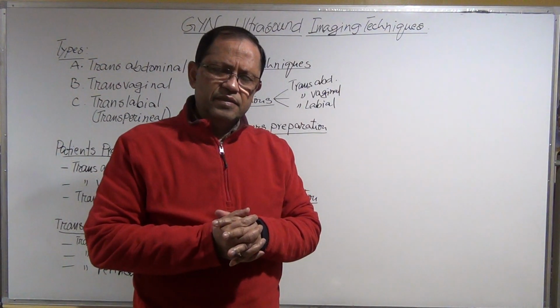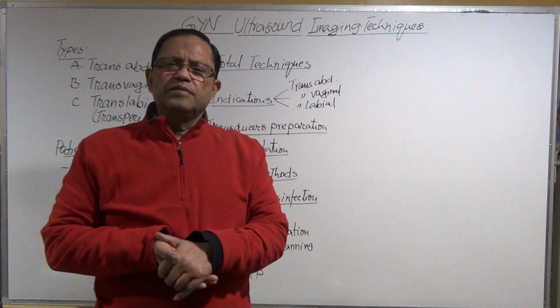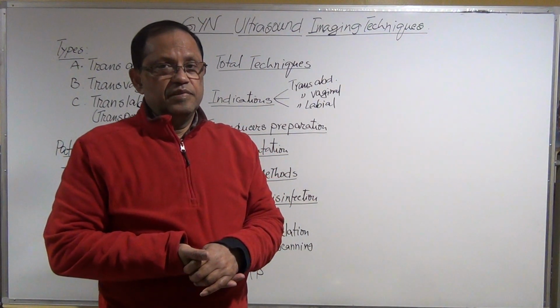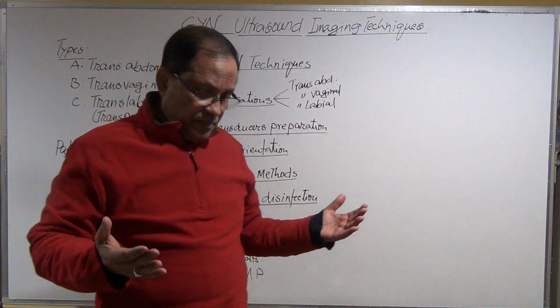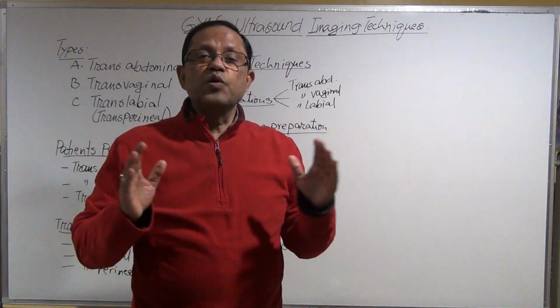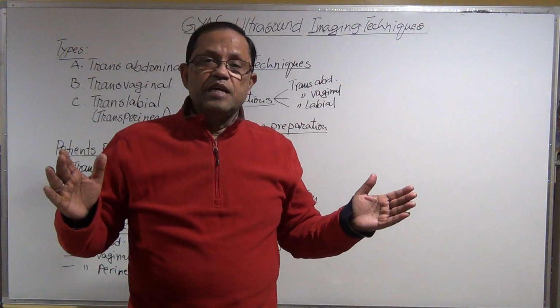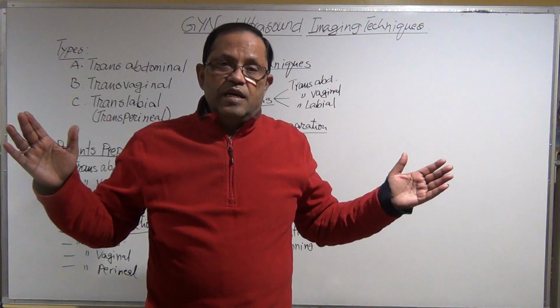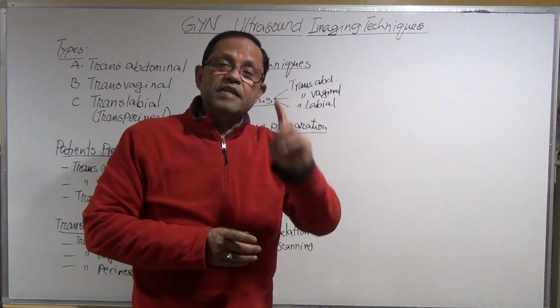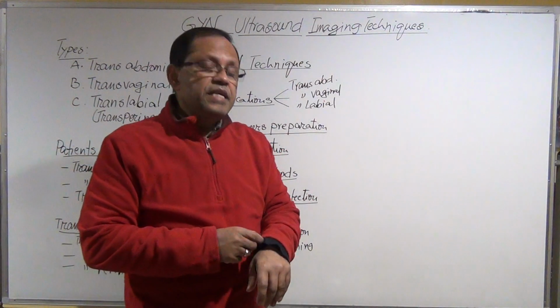Because people say that, because of the invention of the transvaginal transducer, nowadays the diagnosis of female reproductive diseases is so accurate, and their sensitivity and specificity is more than 95%. But it needs a trained operator.